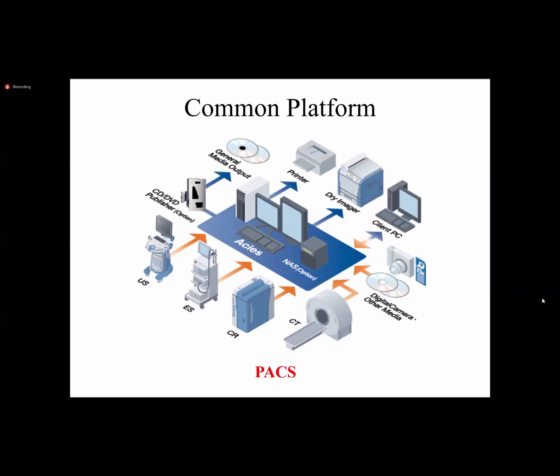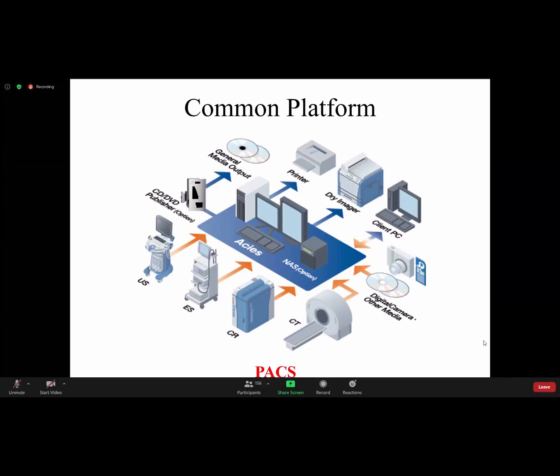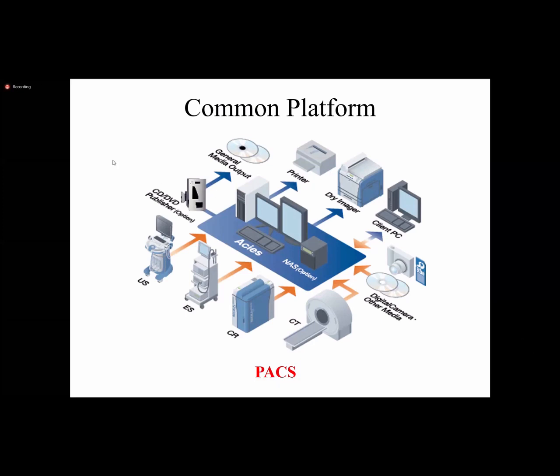If a patient comes for multiple imaging in the department, like X-ray, CT and MRI, and the radiologist needs to report, and we do not have a PACS system, then what do we have to do? The radiologist first has to go to the X-ray system, then move to the CT, then move to the MRI. He has to move around for comparison or reporting. But if we have the PACS system, the radiologist can sit at one place and do the reporting from one workstation only.